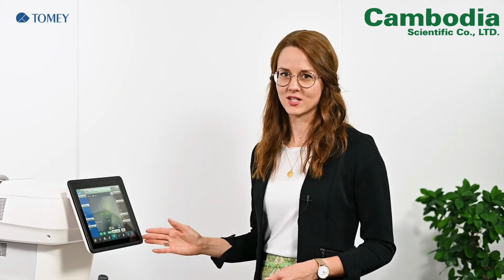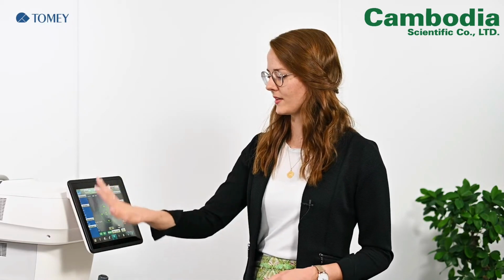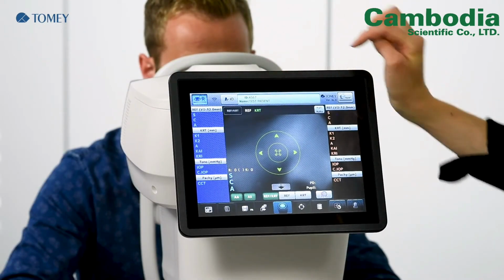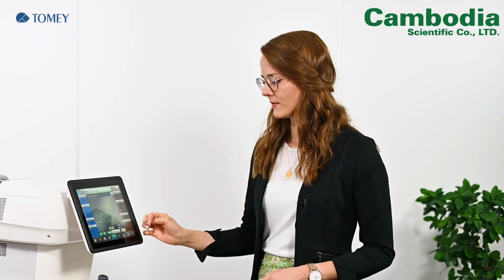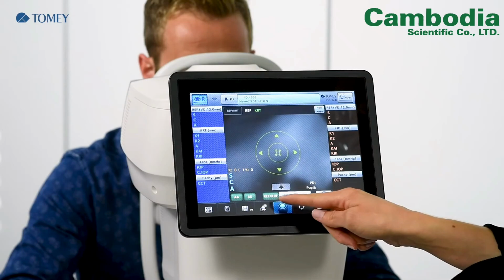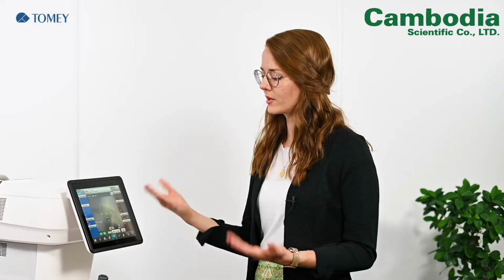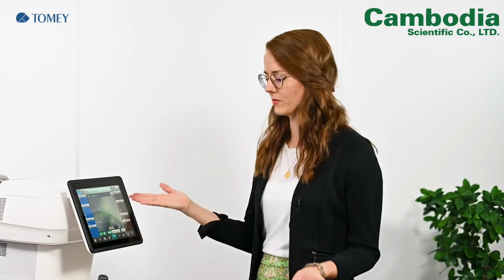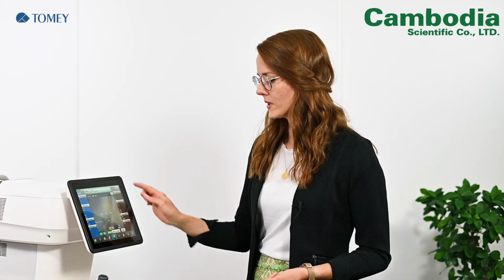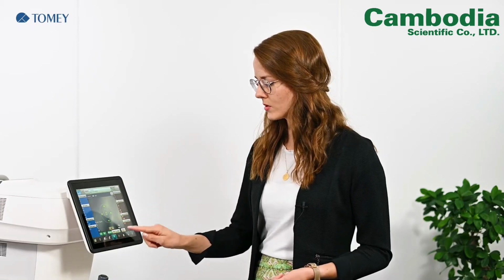After entering the patient, you will find this display, and here in the top line you see which examination mode is activated. With the first startup, you always get into the Ref and Keratometer mode. Or if you change it in the default settings, of course, you can also start up with Pachymetry or Topography. So we start with the Ref and Keratometer mode.